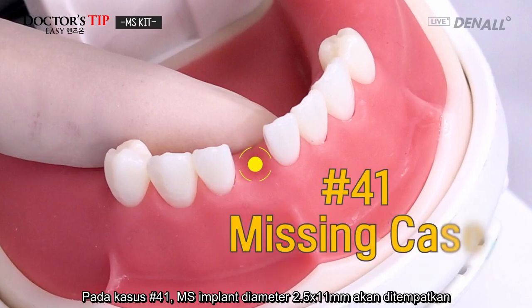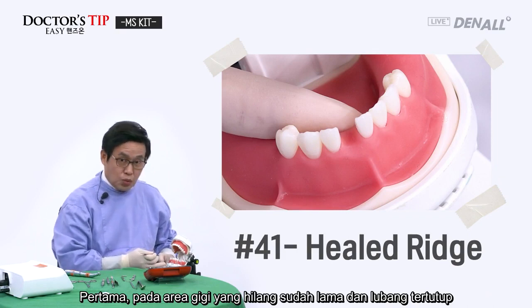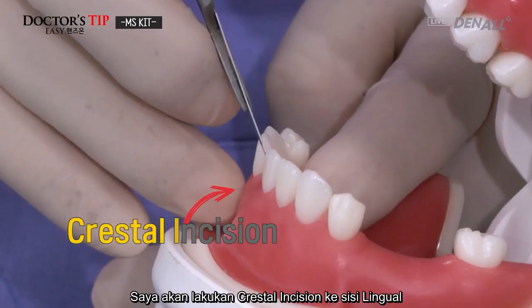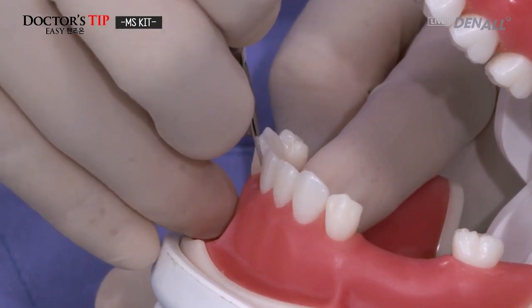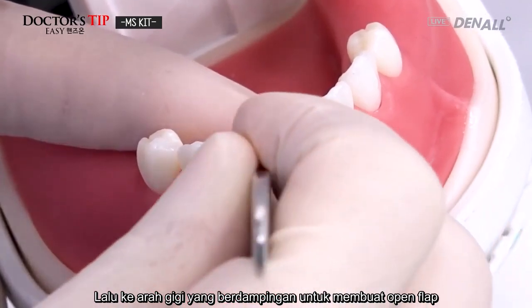41 is missing, and the 2.5 by 11 millimeter MS fixture will be placed first in the missing area. It's been a while since the tooth was taken out, so it's a healed ridge. So I'll do a crestal incision toward the lingual side. To the adjacent teeth, I will release and open the flap.